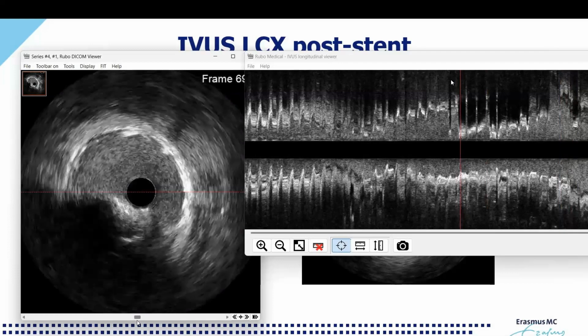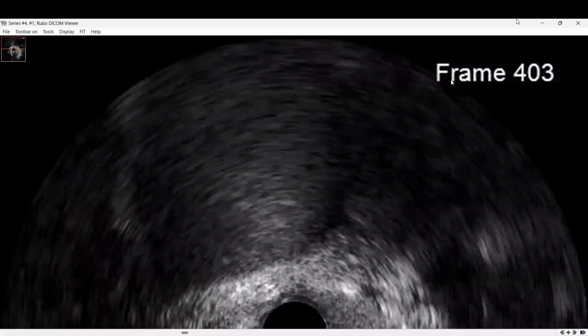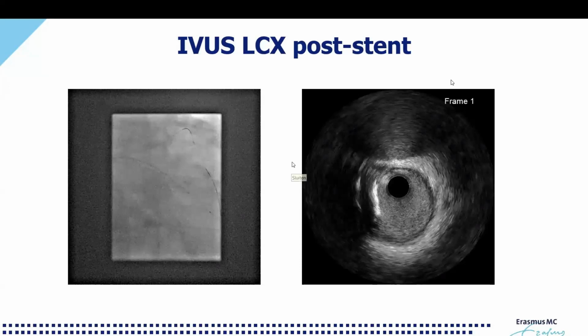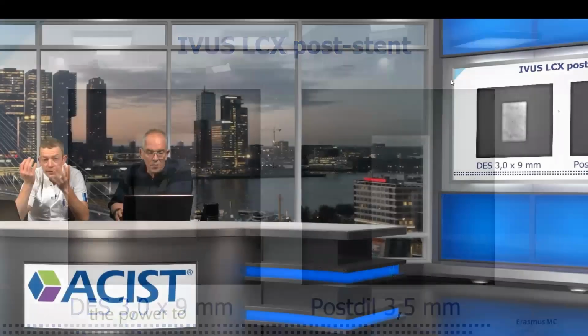So if you go back to the case, you see, we sized this on IVUS, but yet we missed the distal part of the plaque, and we ended with a small dissection and hematoma. So again, a reason to repeat the imaging. If you have the catheter already on the table, it is already flushed, you simply move it forward and you can use it for an infinite number of times. It will take you less than a minute.